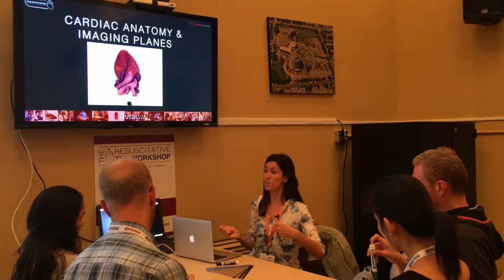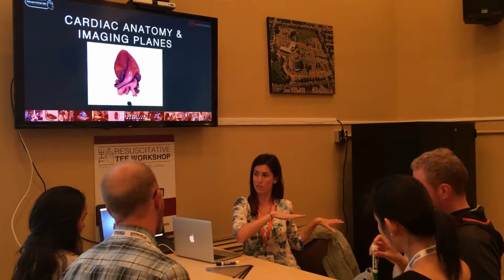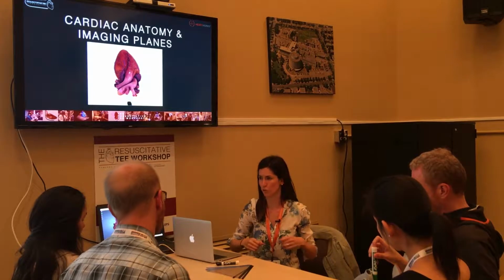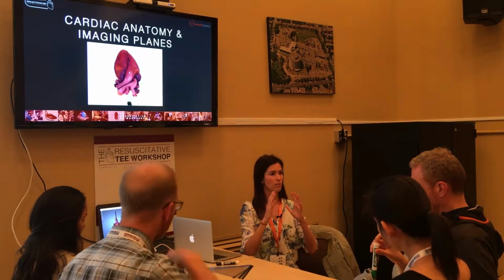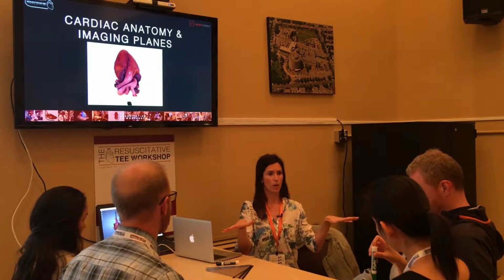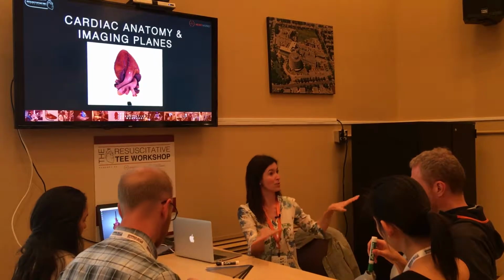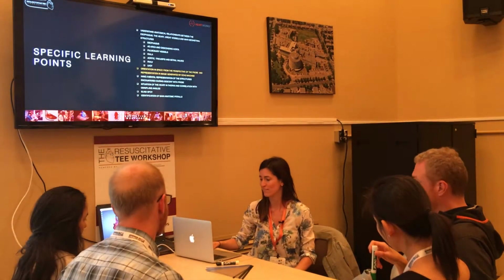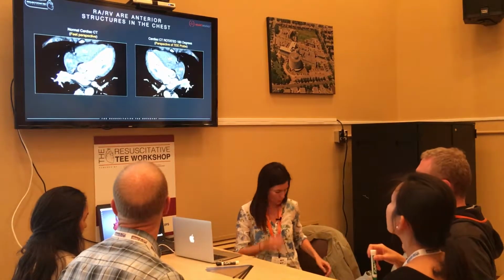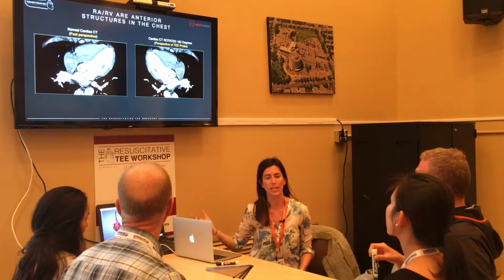You'd have to do some rotation, right? Because you rotate the probe to the left, it's located posterior to you before you're able to see it on your screen, okay? So that's what we're going to think about, thinking about you as the probe within the esophagus and where the different structures are located spatially, whether it's in front of you, behind you, to the right or to the left, all right?